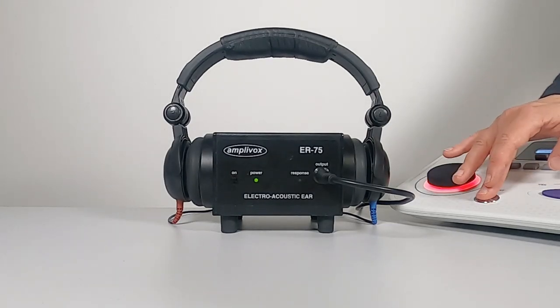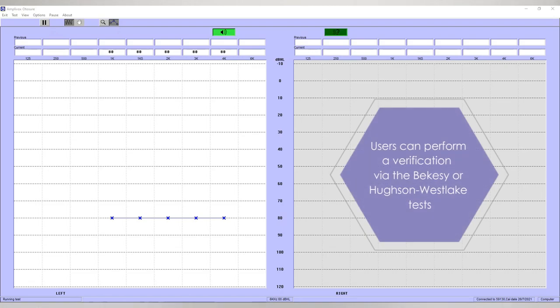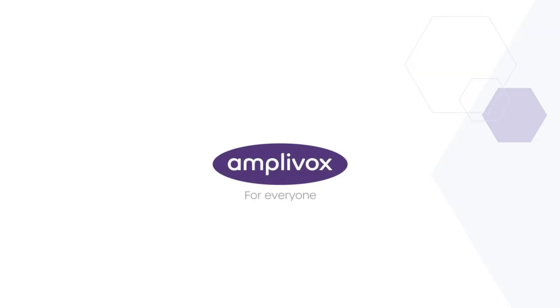Step 6: Move to the next frequency and repeat this process. As a tip, users can perform an auto test of this verification using the Bekesy or Hughson-Westlake tests and keep the results on file and compare them where required. For more information, visit our website or YouTube channel for more video content.